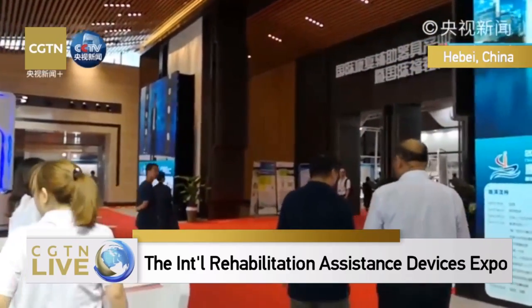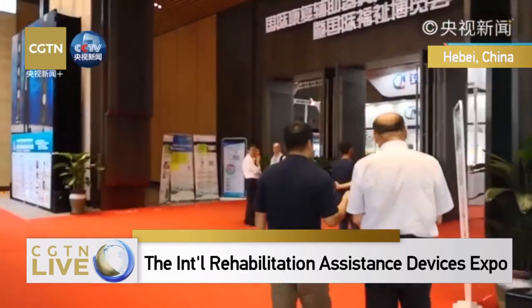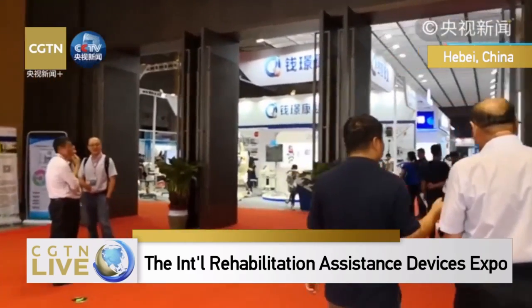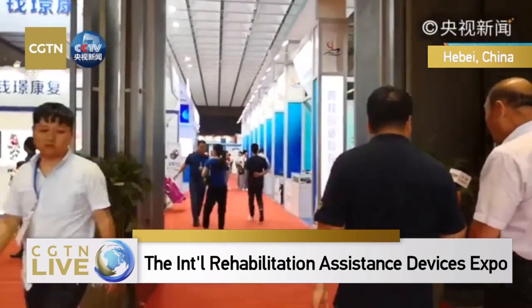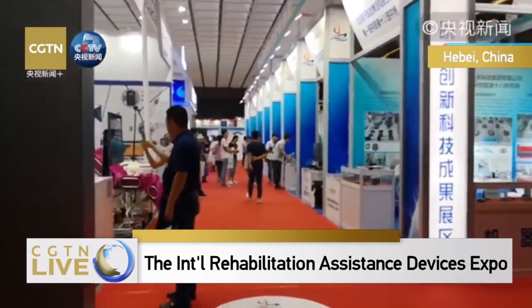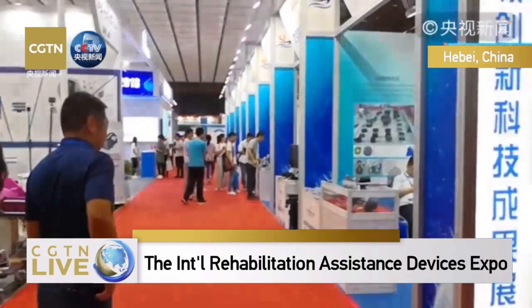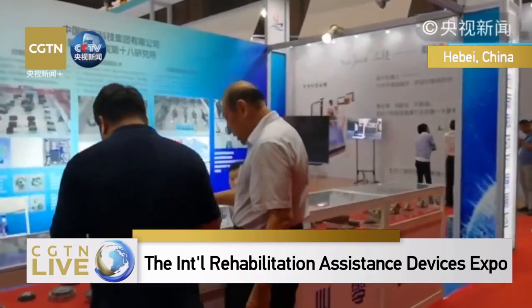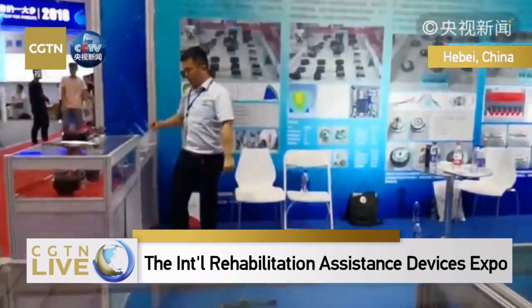Therefore, we also invite universities and research institutes, and we have a special exhibition hall for them so that they can demonstrate some of their lab products and results in this special zone. Some of them used to be used in the army, and will hopefully be used in our daily lives in the future.